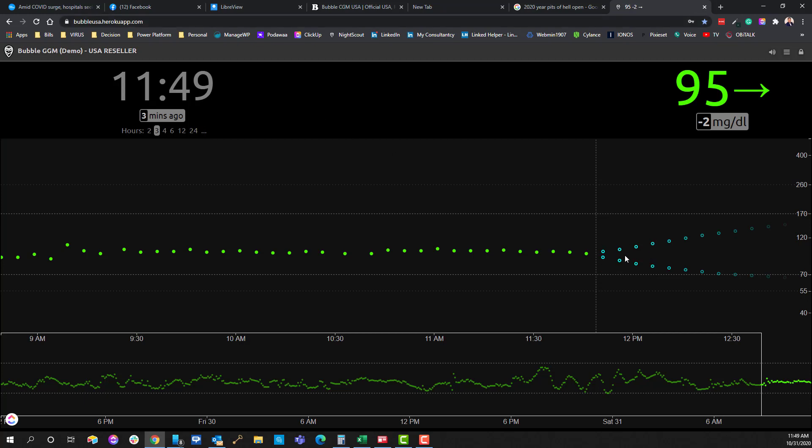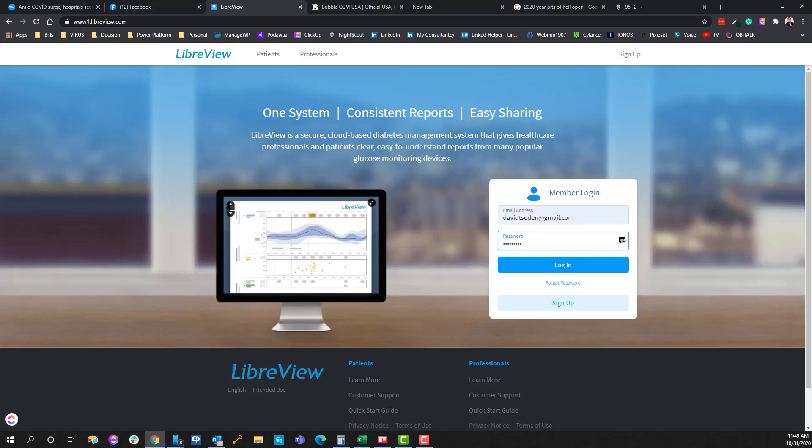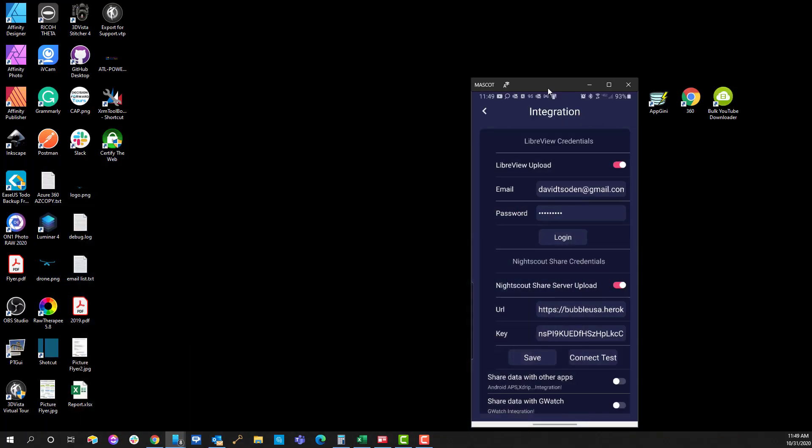If you're not sure what that is, give us a call. We'll be more than happy to consult with you and you can hire us to set it up for you. Now back to what we want to show here which is the LibreView.